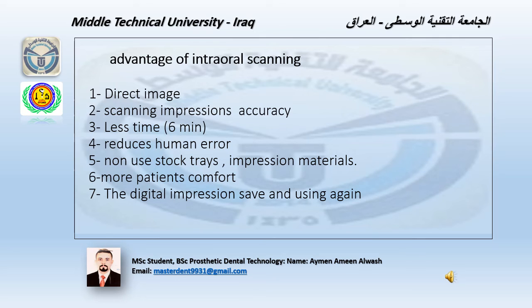Number 5, non-use of stock tray and impression material, ما راح أحتاج stock tray و impression material for record the impression. Number 6, more patient comfort طبعا راح يكون more comfortable to patient. أما بالنسبة ل number 7 the digital impression can be saved and used again يعني نقدر نحتفظ بالبيانات ونستخدمها في وقت آخر.